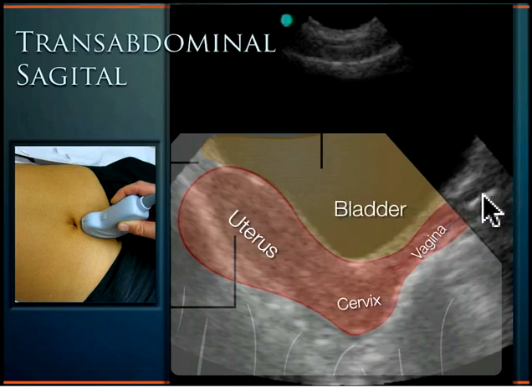We see the vaginal stripe seen here terminates at the cervix, and the uterus is stretching out here, posterior to the bladder. So this is the anterior cul-de-sac, the fundus of the uterus is here, and this is the posterior cul-de-sac back here.